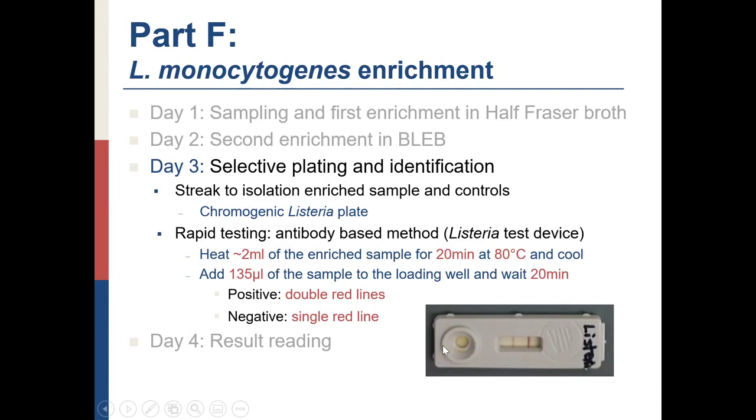This very last one is for Listeria. Again, a positive result is two red lines, and a negative result is a single red line.